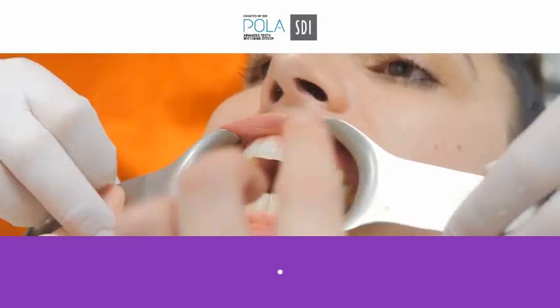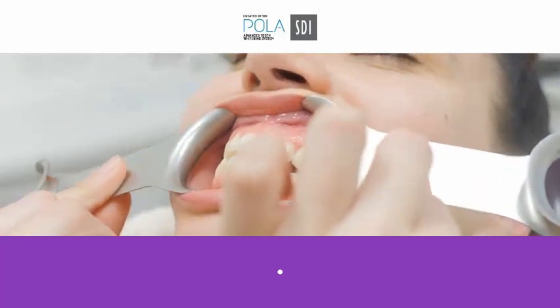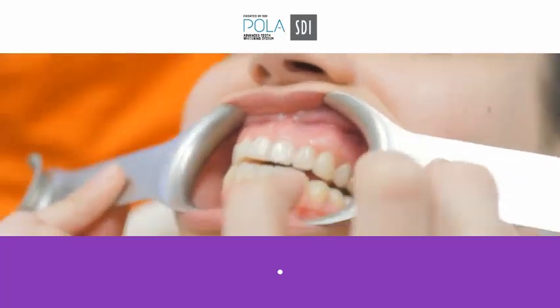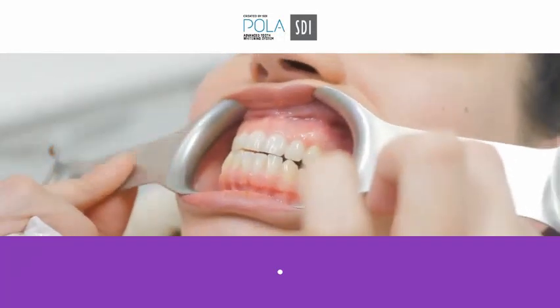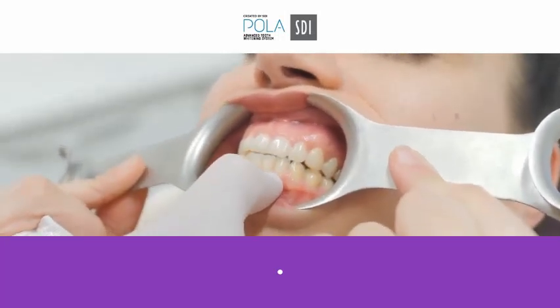Keep it back together for me. Yes, wonderful. That's easy, isn't it? Just take your jaw back, just normally, put your teeth together normally.